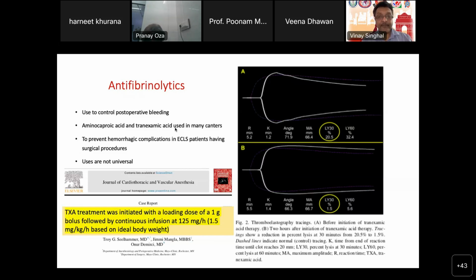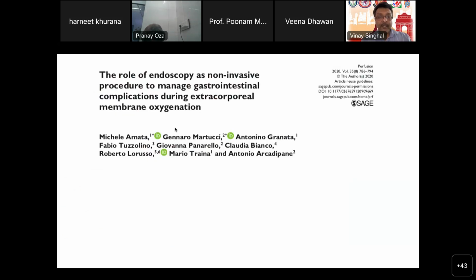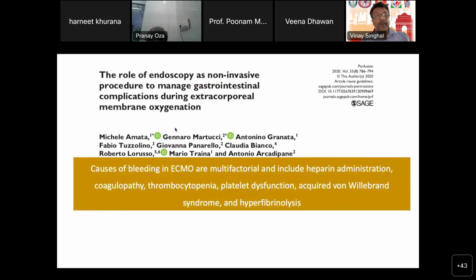Next slide, please. Next, please. We had already discussed this. So next, role of endoscopy. And again, endoscopy is one of the common procedures, and it is life-saving, because causes of bleeding in ECMO are multifactorial and include heparin administration, coagulopathy, thrombocytopenia, platelet dysfunction, acquired von Willebrand syndrome, and hyperfibrinolysis.